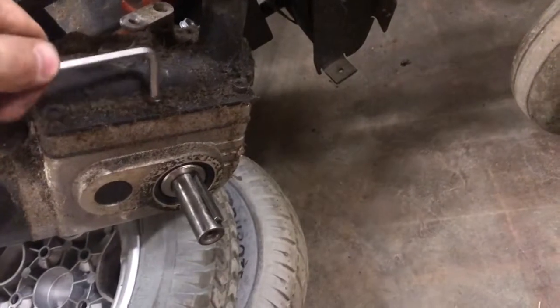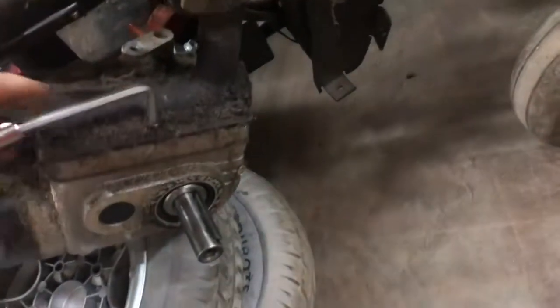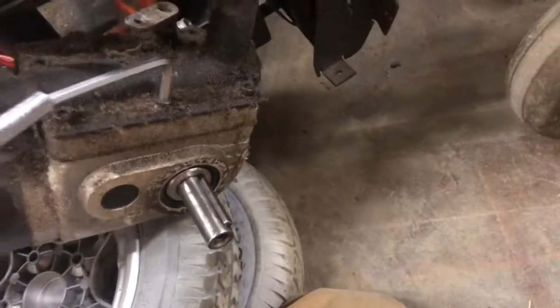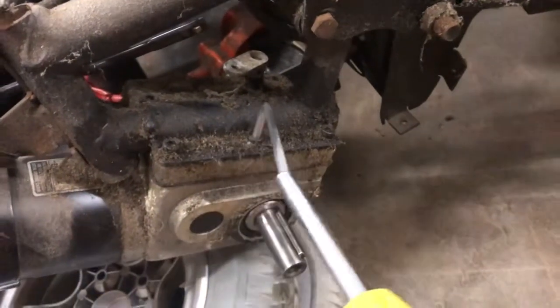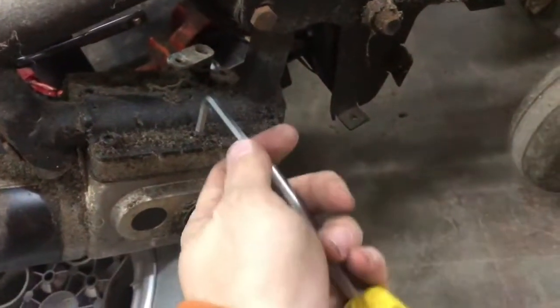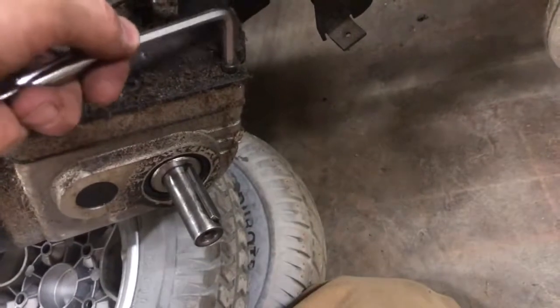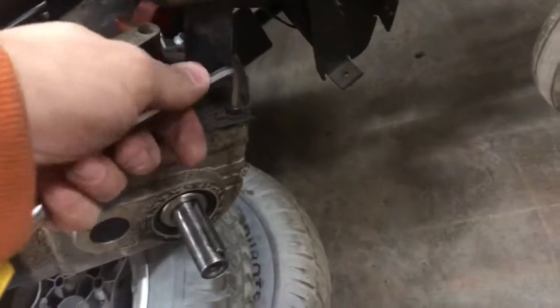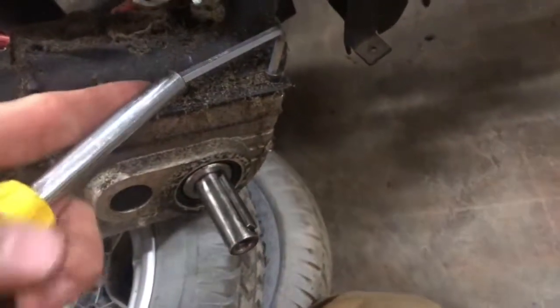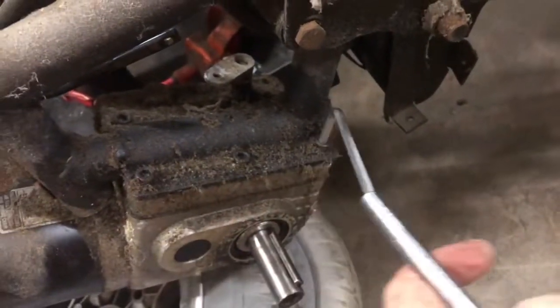Okay. I've seen these strip before. It's not a good day when it happens. Actually, these should be making a popping sound. It's interesting that it's not. Because once you turn it enough, the sealant that's on these screws would break and you'd hear a popping sound. So if you do hear a popping sound, it's normal. Somebody's obviously been in here before. There we go.